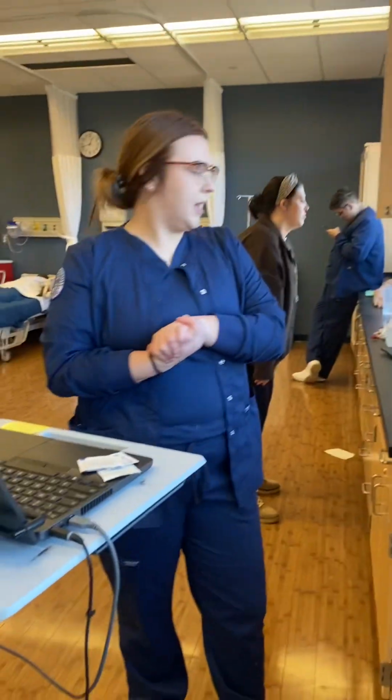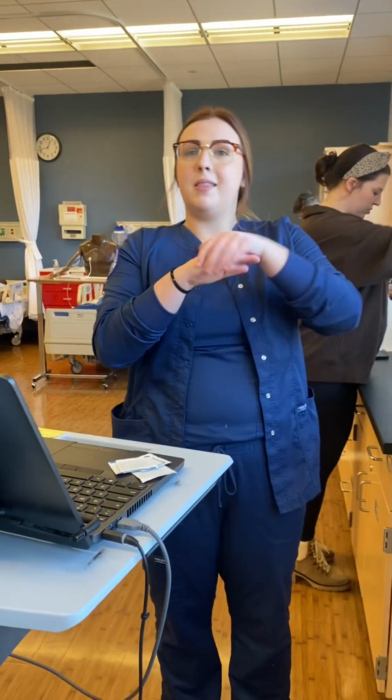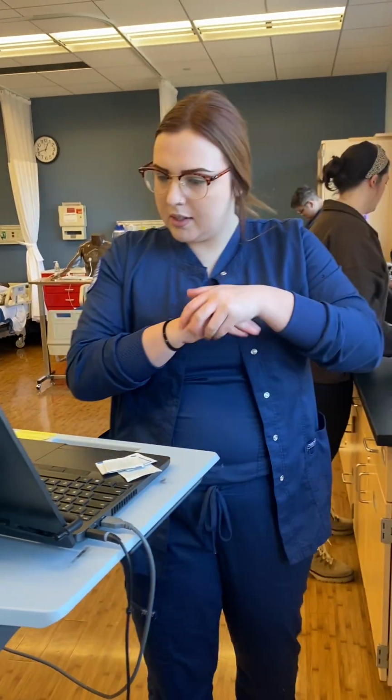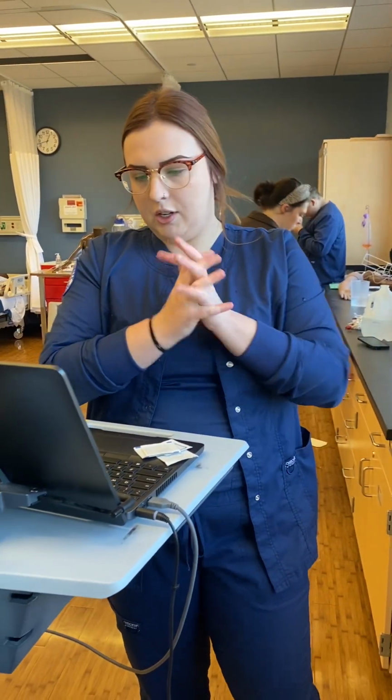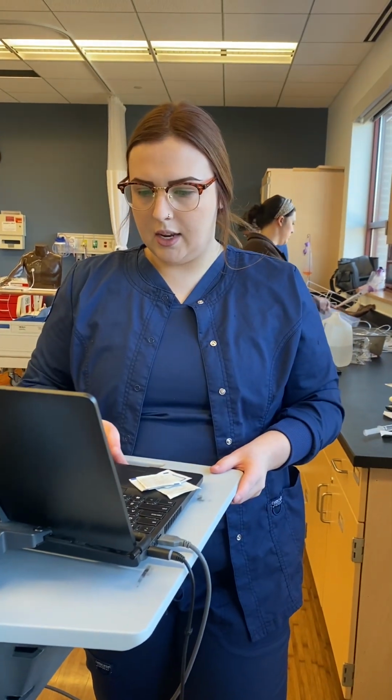Alright, I'm Morgan in the Monday 8 a.m. lab. So I'm in the med room. I'm going to be getting an IV push medication to my patient, Red Yoder. So I'm in his MAR. I see he needs furosemide, 10 milligrams IV push, 10 milligrams in 1 milliliter.